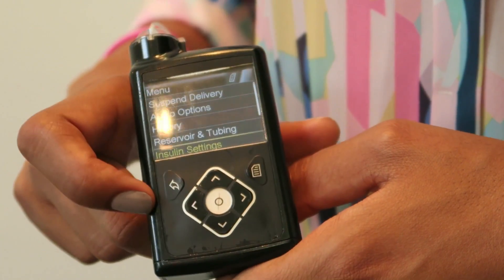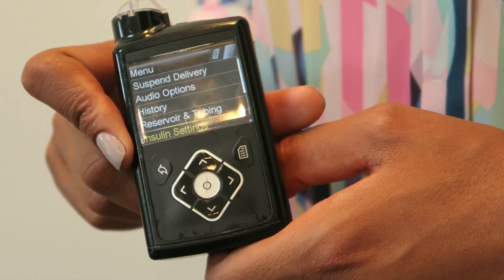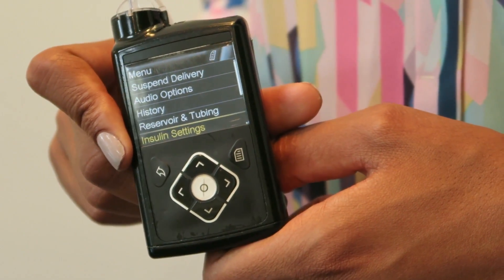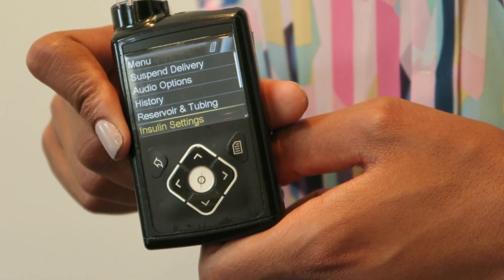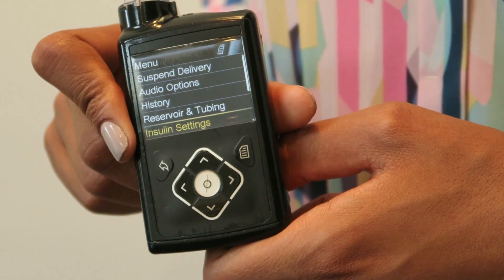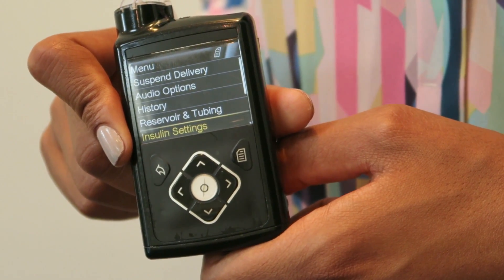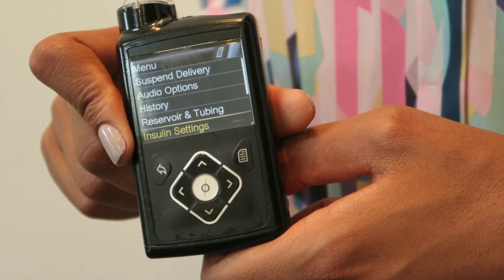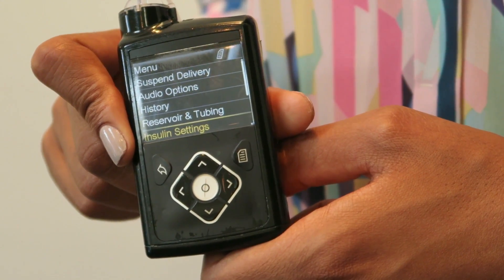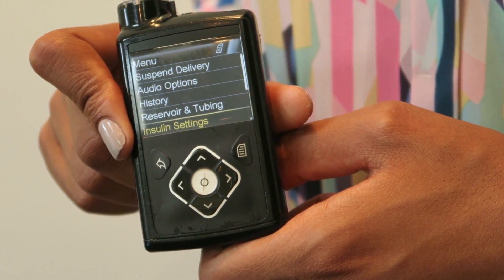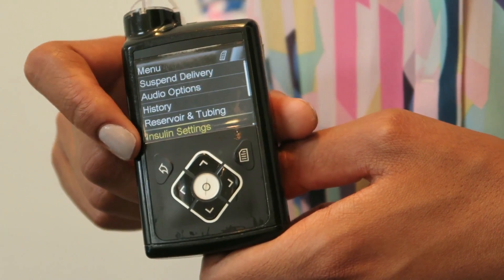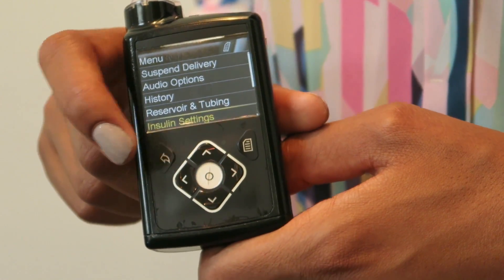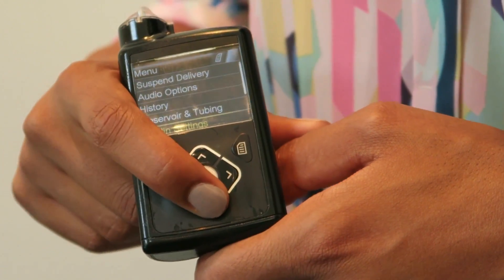We've then got the insulin settings themselves. There's more than one way to give insulin — you don't have to give it all in one go. You can split up the dose in different ways, and all of those options are in here.